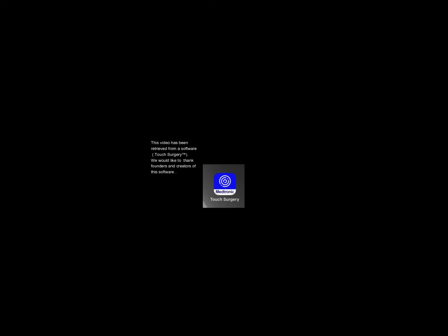Lag screw fixation. This video has been retrieved from Touch Surgery software. We would like to thank the founders and creators of this software.